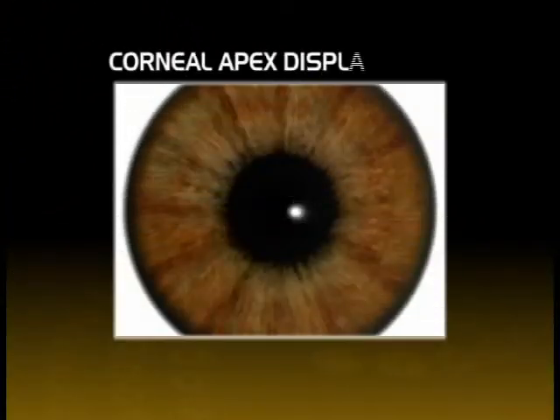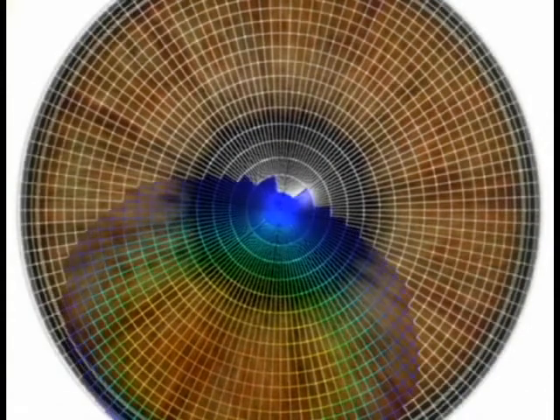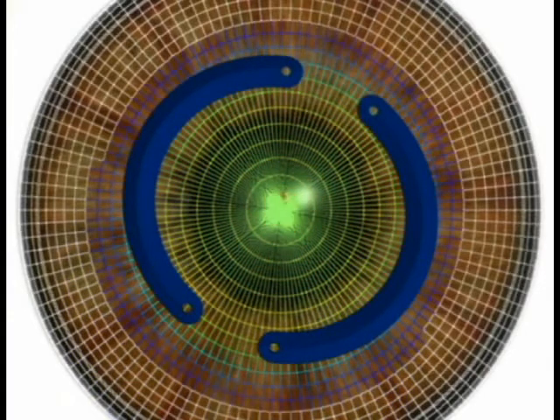Corneal apex displacement. In keratoconus patients, the corneal apex is usually decentered in relation to the central pupil. Keraring implantation displaces the corneal apex toward the center, improving corneal optics and visual acuity.